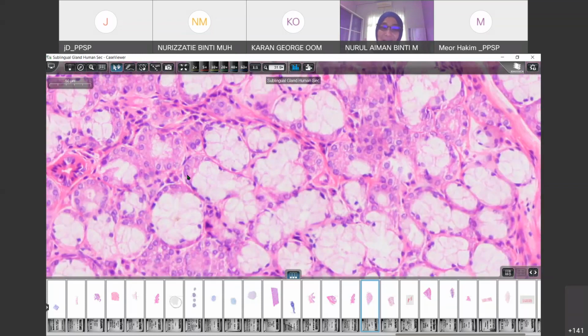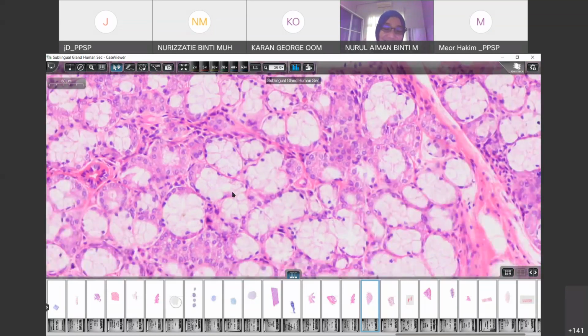This is simple, as in the diagrammatic representation. In a line diagram it is very easy for you to understand. They just want to make it easy for you to understand. But of course the real one is not as simple as that. I already stressed this in my lecture yesterday. But it's okay, now you understand.